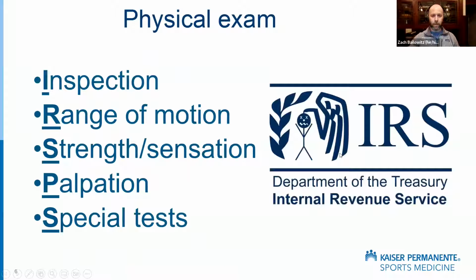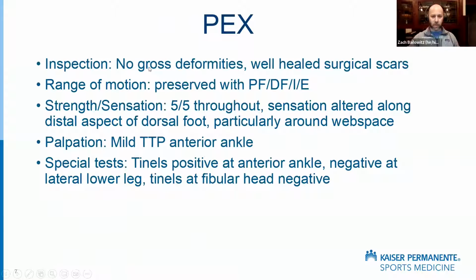When I teach my fellows and residents, I always try to be very algorithmic in terms of my physical exam. So the IRS pestered students is the mnemonic I typically teach. This is certainly just one order, there are many orders to do this, but make sure that you're staying true to the order that you learn. So inspection wise, no gross deformities. There were a couple of well-healed surgical scars. She actually had good ankle range of motion, well preserved and symmetric to the contralateral side.